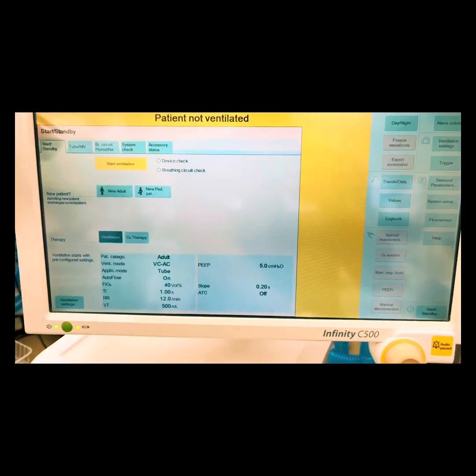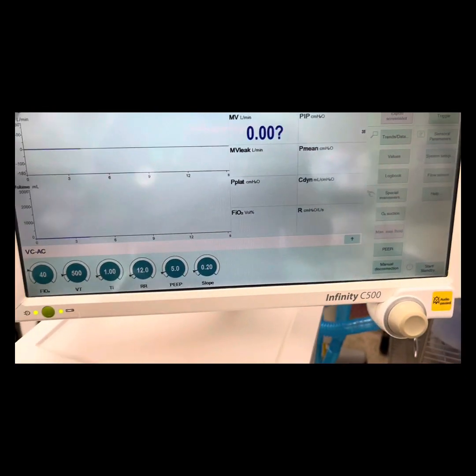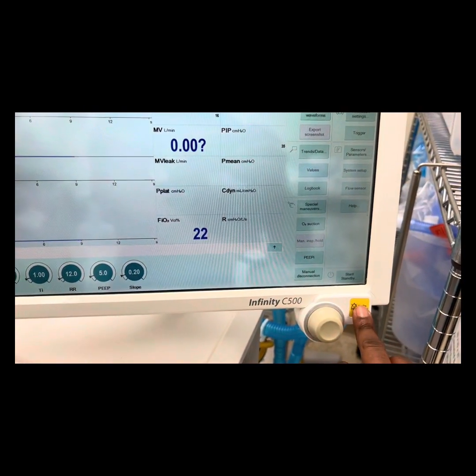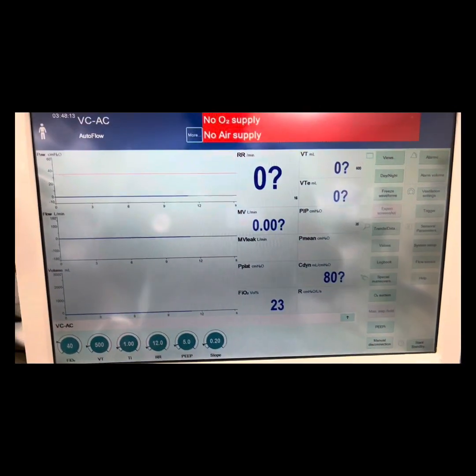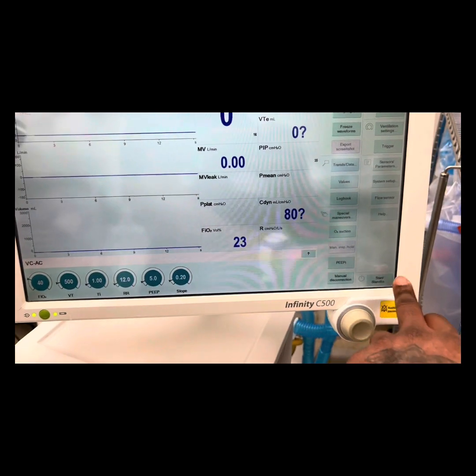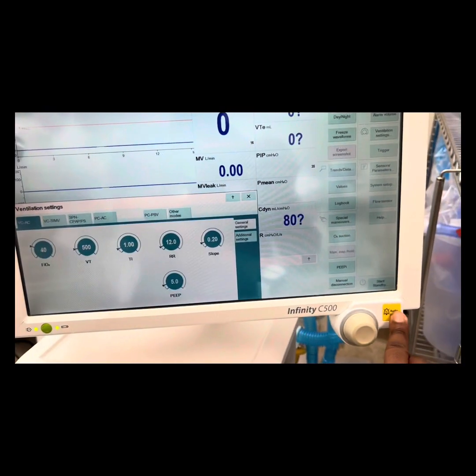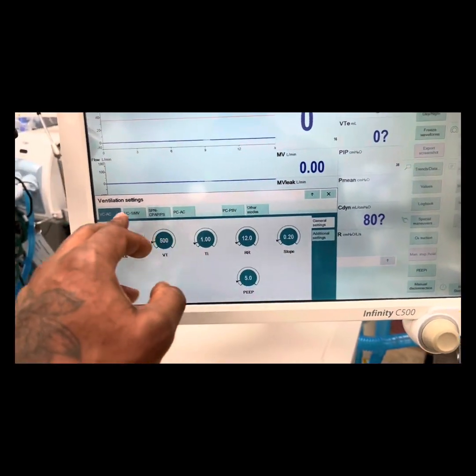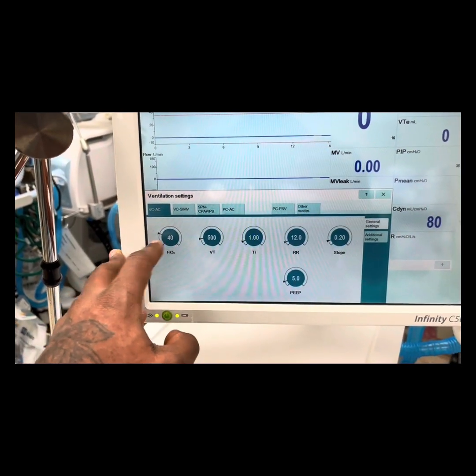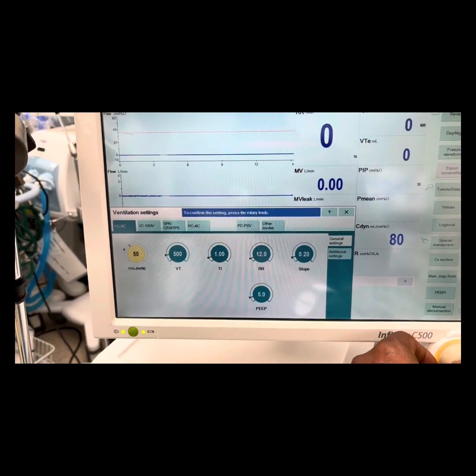That's how we get to our settings. It's not connected to the air or the oxygen. Go to settings, then more. Ignore this noise. From here you can select SIMV or AC — push, push, then select.